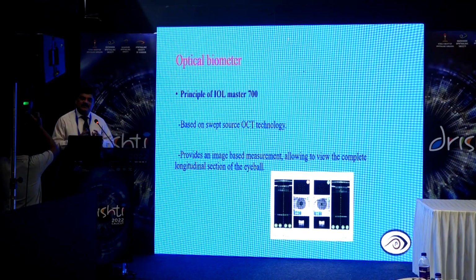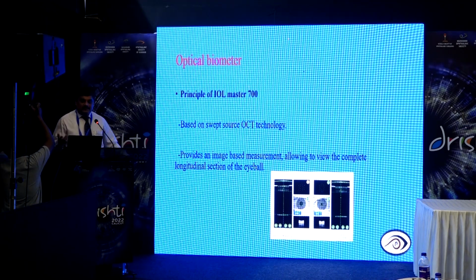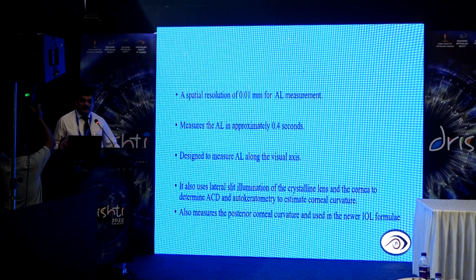The basic principle itself is different. It is based on swept-source OCT, so it gives a much better result because it measures the axial length in almost 0.4 seconds, and is designed to measure the axial length along the visual axis.